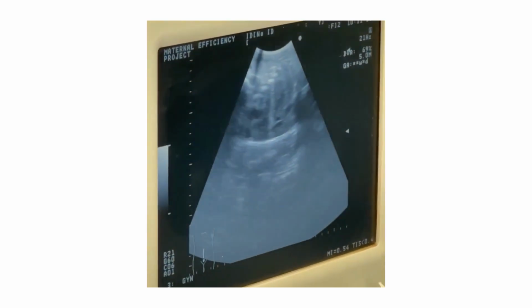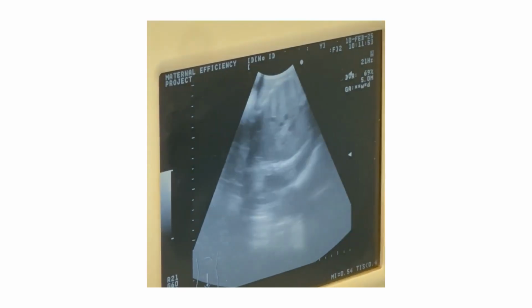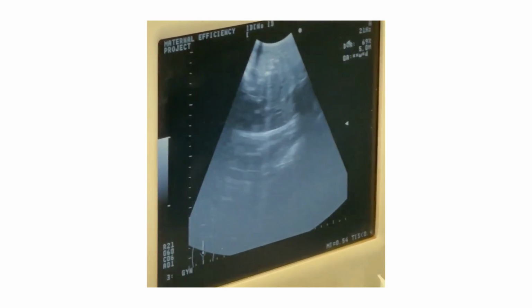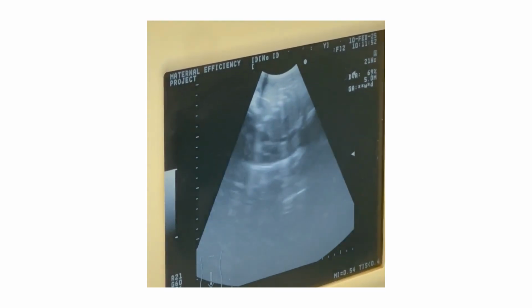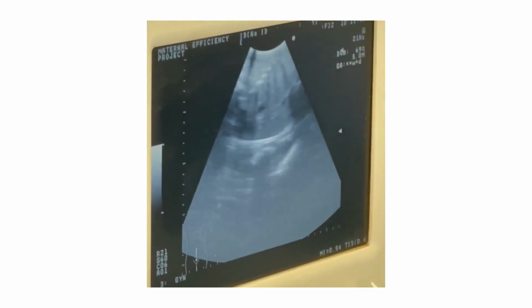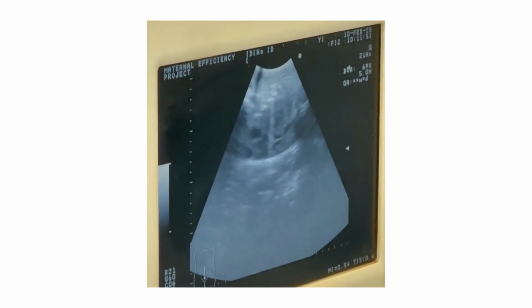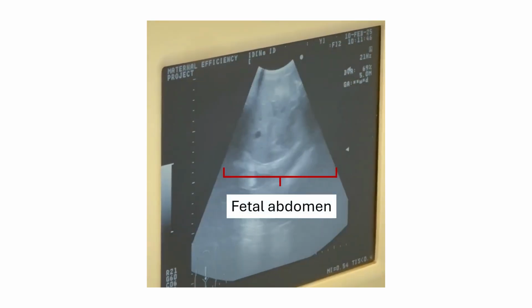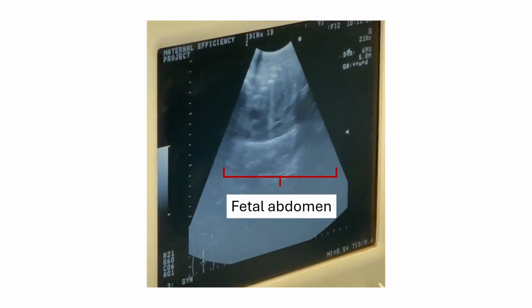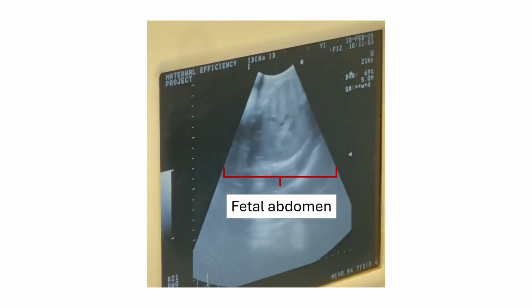We've got an example here of looking for the fetal heartbeat. This is a great example of looking into the fetal abdomen and looking at all different tissue types to see the example of how sound is transmitted and how this may look on your ultrasound image. This overall picture is the middle of the fetal abdomen. We can see the liver, and on the left-hand side, the heartbeat.